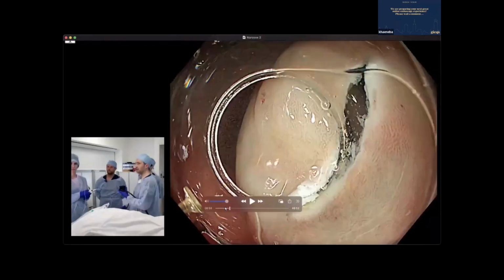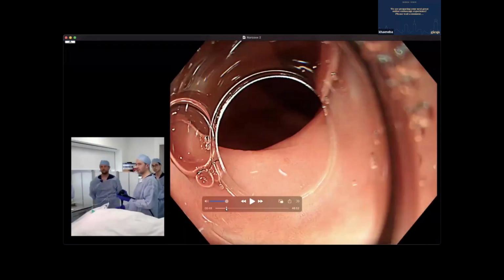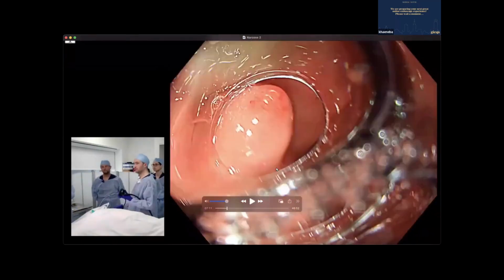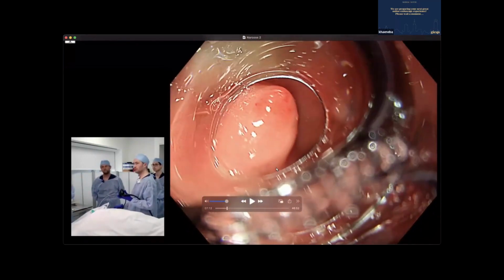The lesion, very small. Should you have cut it out or not? I think that's something to discuss with your patient. Do they want surveillance or not? What is it? Not sure. All those things are for discussion outside, and we want to talk about technique, okay? But I think it can be discussed whether you left this alone or cut this out, depending on the age of the patient. Okay, then there was, okay, this is in a very annoying position.